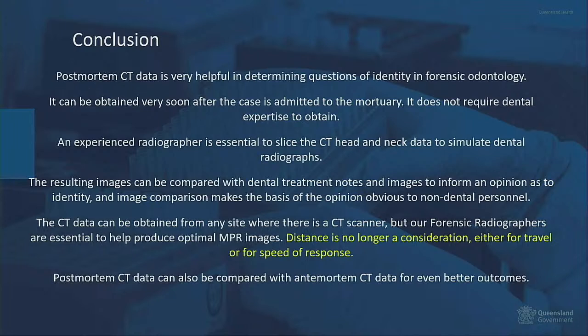And as we look to the future, I would ask you to keep this in mind. Wherever there is a CT scanner, and the body does not need to be removed from the body bag to be scanned, post-mortem data will be available. So distance is no longer a consideration either for travel or for speed of response. If you have post-mortem CT as well as ante-mortem CT, then you have an even better option for identification. But I haven't illustrated that in this presentation.